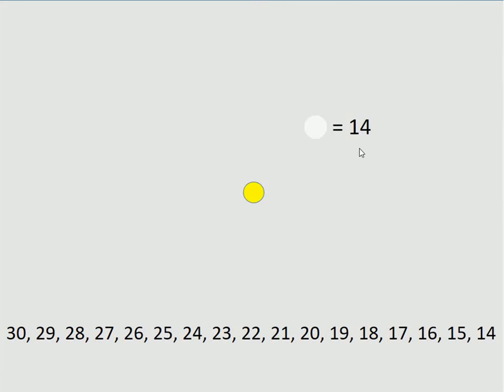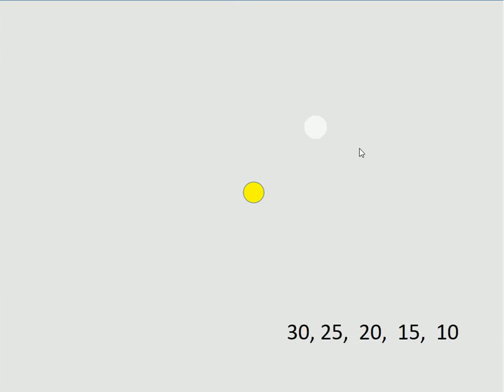Obviously, this would take an extremely long time. Another approach would be to do the opposite, for the sake of time, to try to go a little bit quicker, and the machine would make jumps by 5 until the patient finally clicked to say that they saw it. But would it obviously be fair to conclude that the score was 10 over here? So obviously not. And so what could be done in this case?